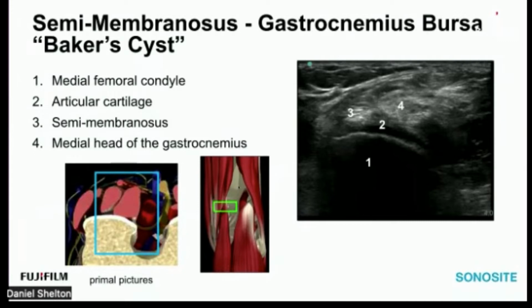So if you are already doing ultrasound and maybe you've seen Baker's cyst back here, there's also artifact associated with the angle of the ultrasound beam, especially in the shoulder. We showed the biceps tendon, for example, for the anisotropic artifact. This is a really big deal back here. So if you're not holding the transducer correctly, you're going to have a dark semimembranosus and a bright medial head gastroc, or the other way around. If you're tilting the probe, say, towards the feet, you may end up with a bright semimembranosus and a dark medial head of the gastroc. And what you don't want to do is go chasing one of those dark structures with a needle to find out that it's solid and it's a tendon and it's not going to be able to be aspirated.